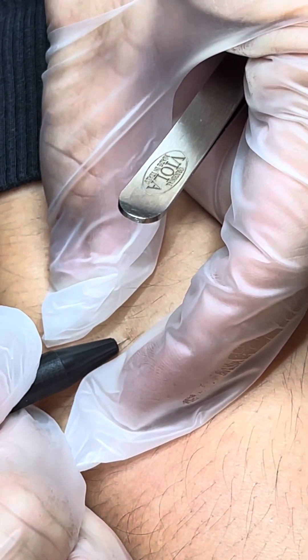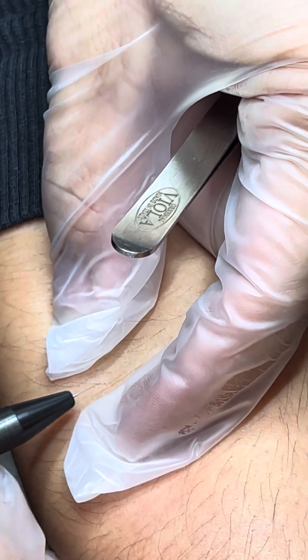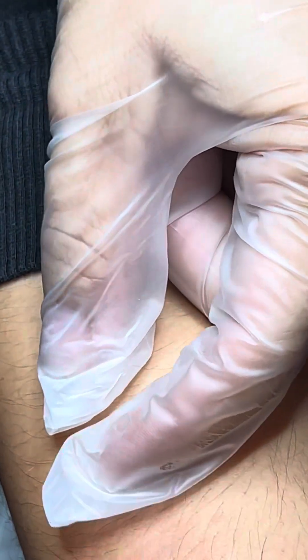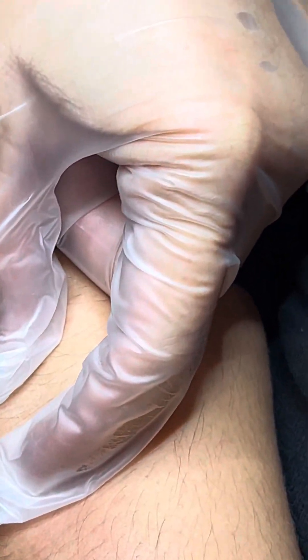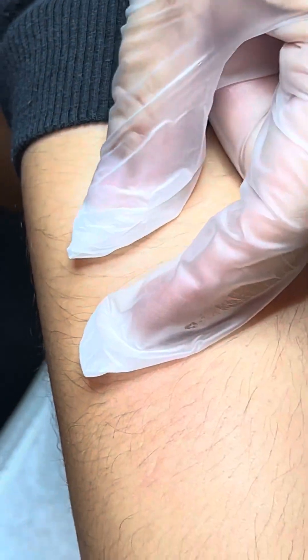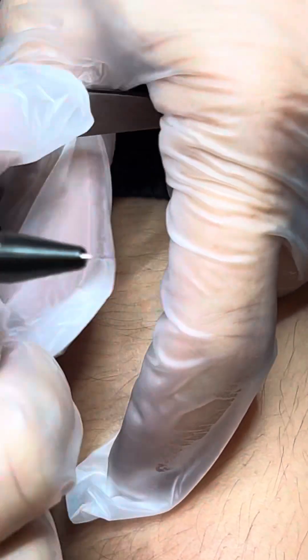There you go — pedal, pedal. And the color — is the light changing in the machine? No? That's okay. Go back in. You have another pair of tweezers right there. That's why we like to have two or three pairs. I lost the hair — I lost the hair. Was it that one? That's okay, I lost it too.